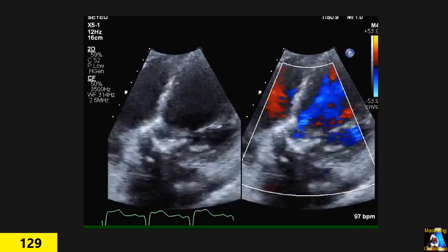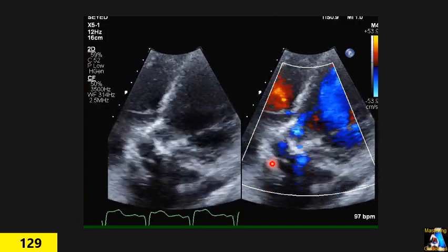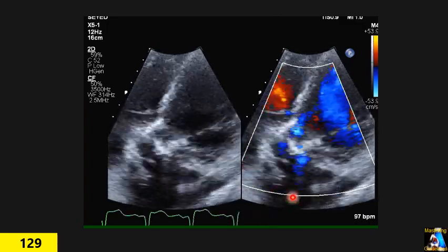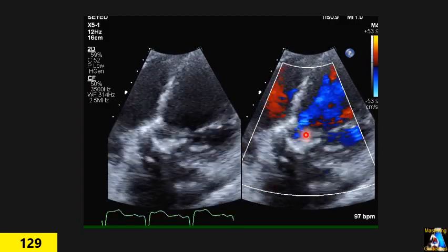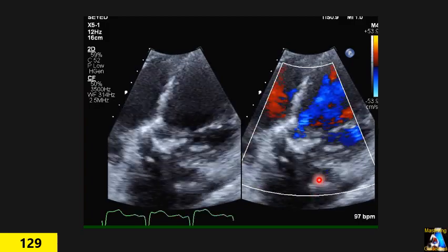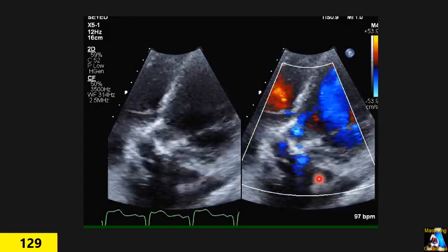And this is the final image on this patient. Again, on this you can see calcification, the aortic valve, this is apical, not subcostal 5 chamber. You can see a little calcification on the valve, a little jet here. You don't see anything beyond that. Do you see any abnormal finding on this that makes you very suspicious to do something? There is something going on with this patient.